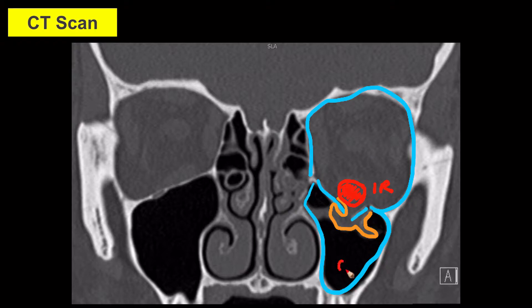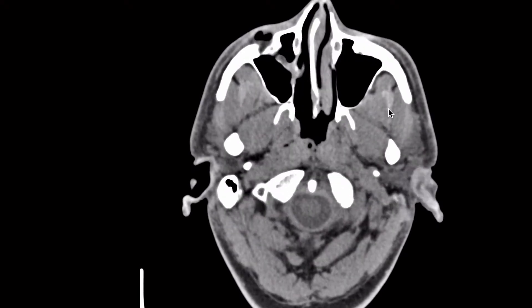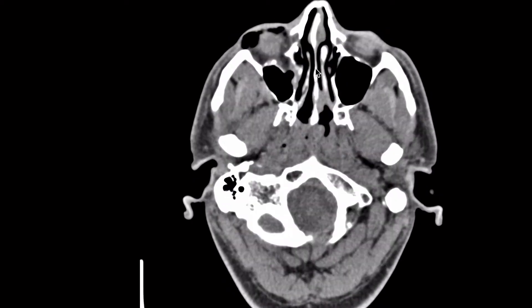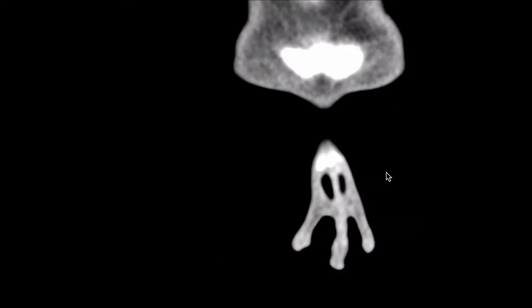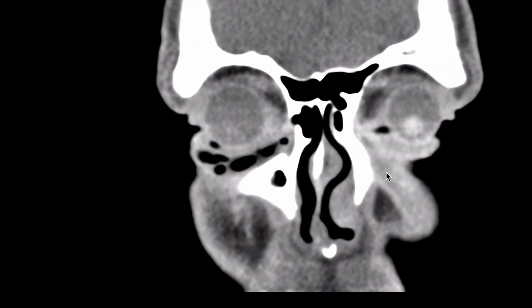Interestingly, in this first case there is no blood pooling in the floor of the maxillary antrum, so we would have seen very little on plain film apart from perhaps the fracture. Here is a second different CT scan. Starting with axial images on soft tissue windows, notice this subcutaneous gas around the orbit — this is surgical emphysema and is a surefire sign that a fracture has entered the maxillary sinus, causing a leak of air. On coronal reconstruction, we again see that gas in front of the orbit.